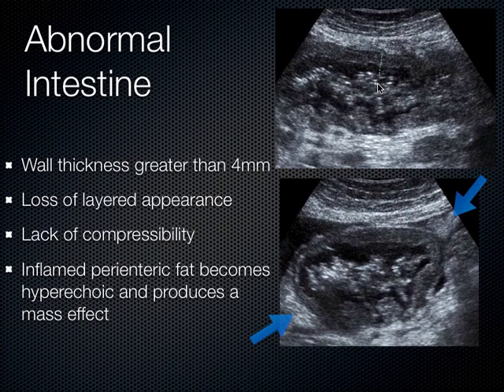rim of the intestine when there's inflammation going on. So in this patient down here that has pseudomembranous colitis, we can see this hyperechoic area here and also adjacent over here. It may look a little subtle to you right now as you're sitting here looking up at these images, but I can tell you in real time, when you go to compress this, all this stuff gets tacked down together, this perienteric fat, this hyperechoic area, and it all moves together. Not unlike the way patients with cellulitis, with skin infections, you see all these hyperechoic islands that you're going to learn about pretty soon that we call cobblestoning.